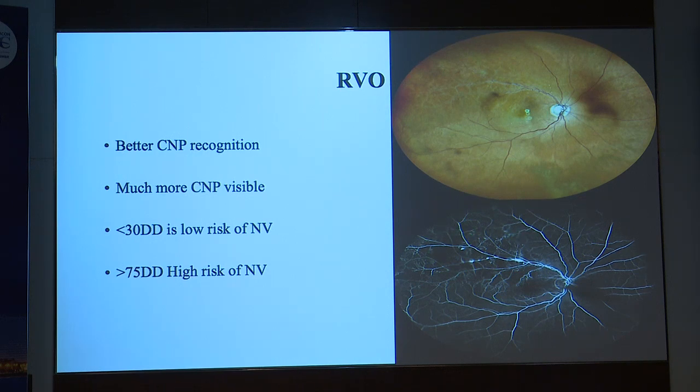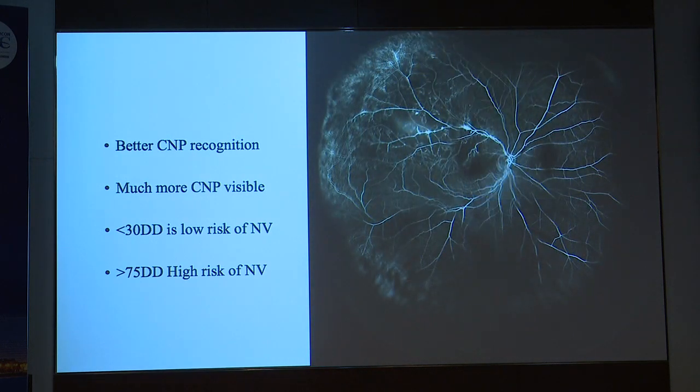So now the concept, even in a case of vascular retinopathy, is to go beyond the equator to complete a sectorial or a pan-retinal photocoagulation, and you are justified in doing so. Otherwise, the standard teaching would be to treat up to the equator, moving from the vascular arcade up to the equator. But these cases will convince you why you need to go beyond the equator. Now this is what ultra-wide field is. You see the extent of the damage.